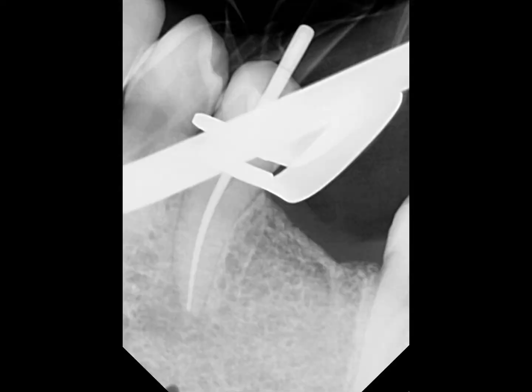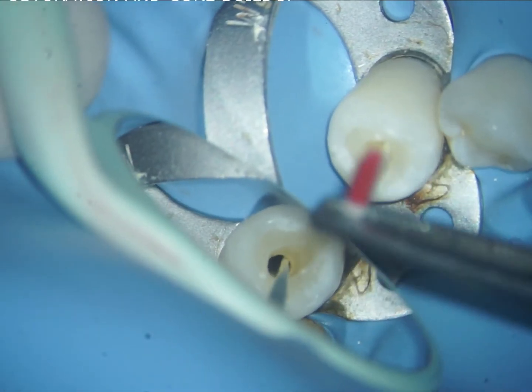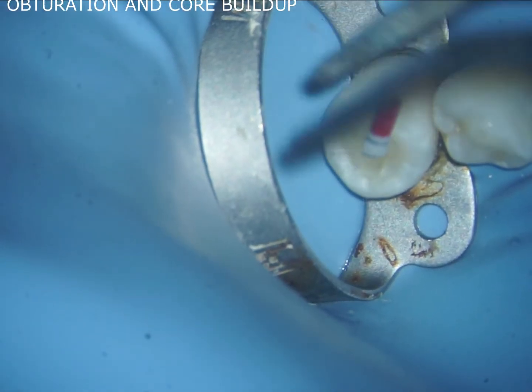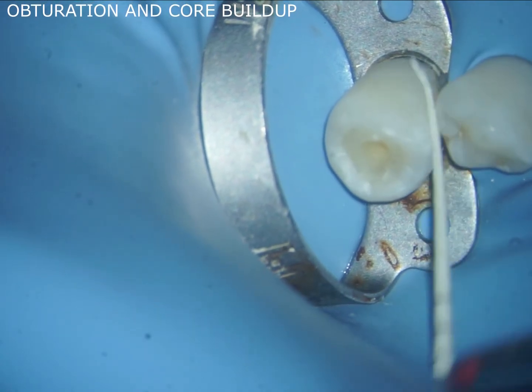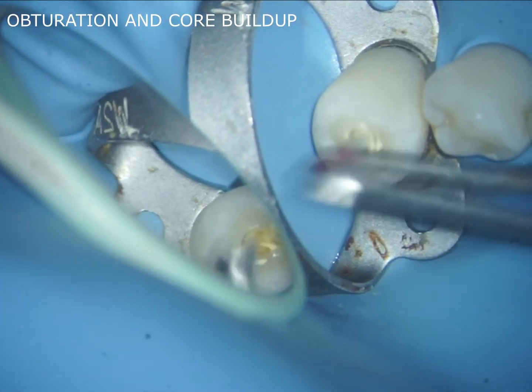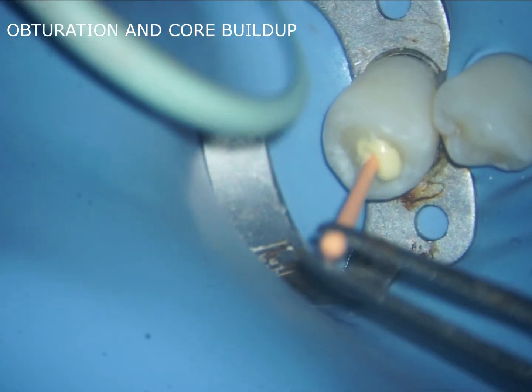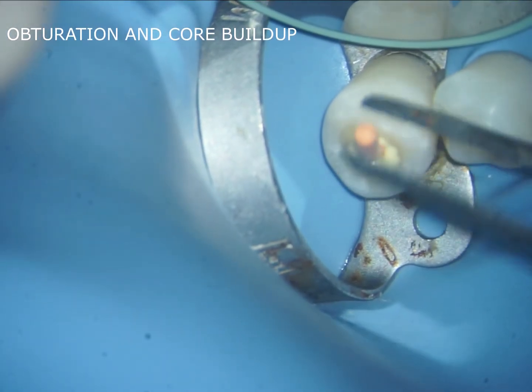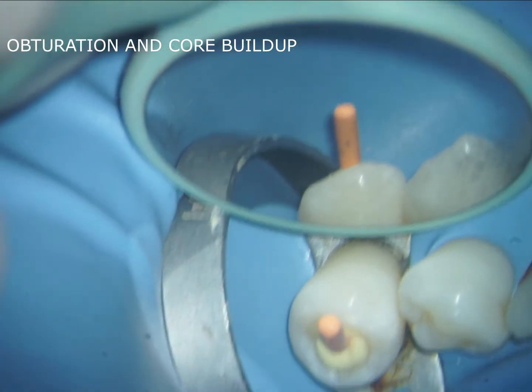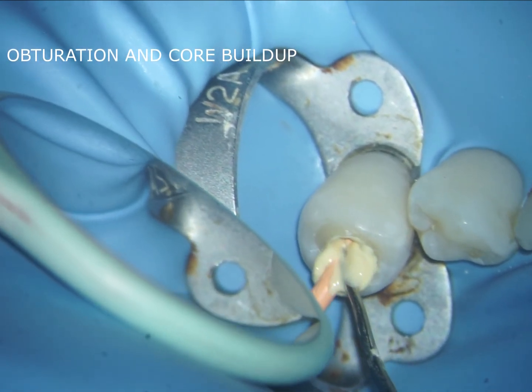This is the master cone x-ray. Now we'll use paper points to dry the canals — the paper points should correspond to the master apical point you've selected; I used 25/04 paper points. We then coat the walls of the canal with a sealer — you can use a lentulo spiral or the master cone or whatever you prefer. Now we're placing the master cone, which has sealer coated on all sides, to the working length confirmed with the x-ray.